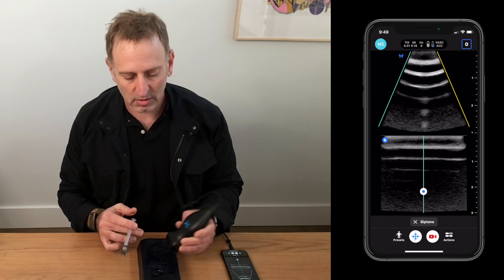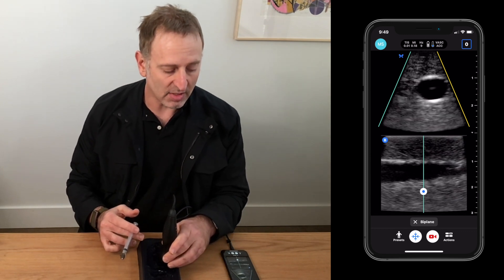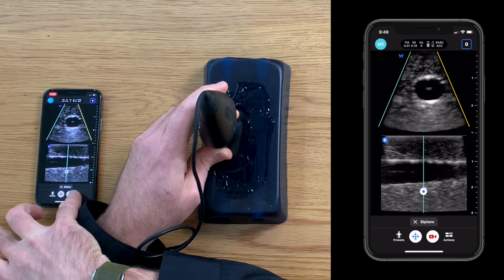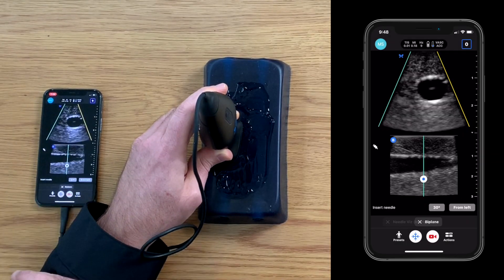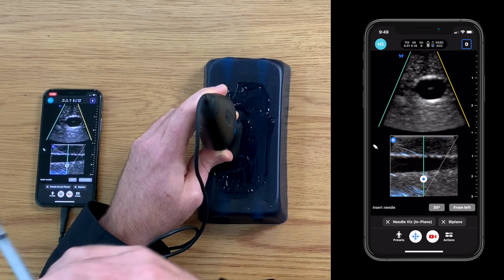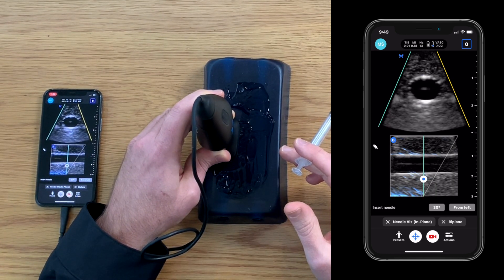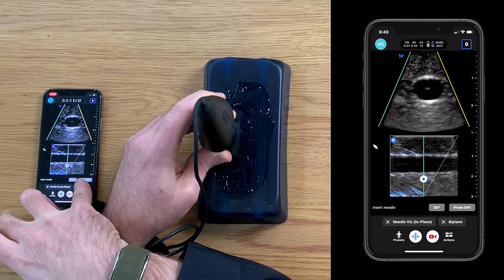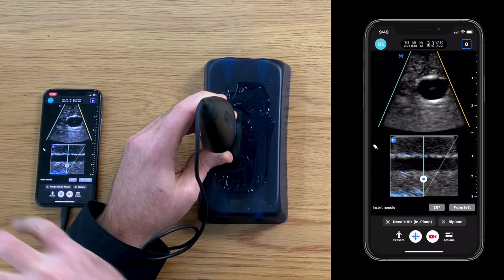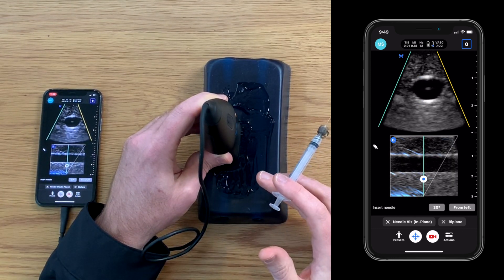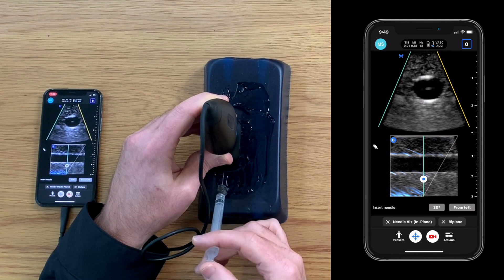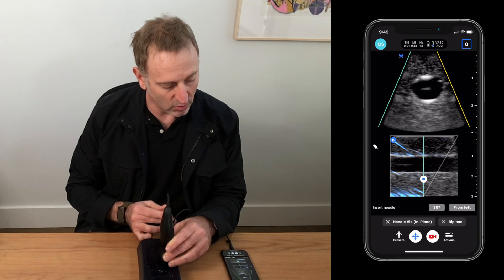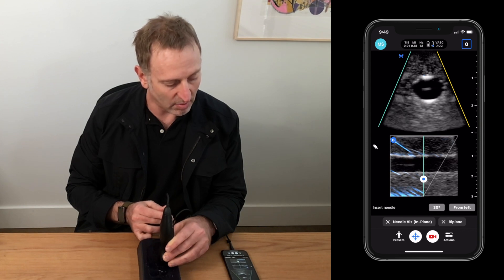Lastly, I want to illustrate that biplane works at the same time as NeedleViz. If we go back to our actions menu and activate NeedleViz, we are going to get a blue highlight over the needle as it's being inserted into the tissue. In this case it's saying insert from the left, which is towards the blue dot, which is facing me — so I know I'm doing that correctly. I'll go ahead and insert the needle, and as I do that we can see that blue highlight over the needle on the bottom image.